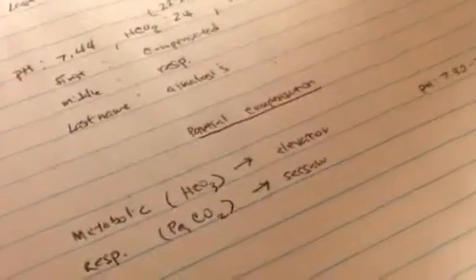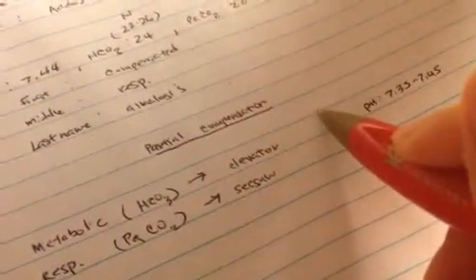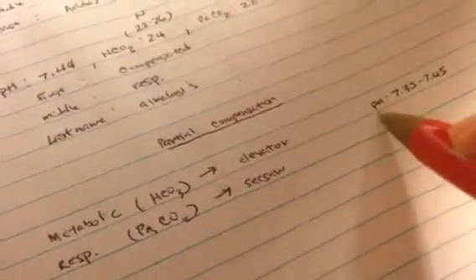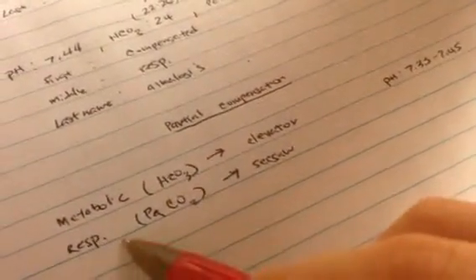What I mean by that is if you compare your pH and, for example, your bicarb, and you see that both of them have increased, like an elevator, then the problem is usually metabolic. Now, if you compare the pH and the respiratory, and the pH is increasing while the respiratory is decreasing, like a seesaw, then the problem is usually respiratory.